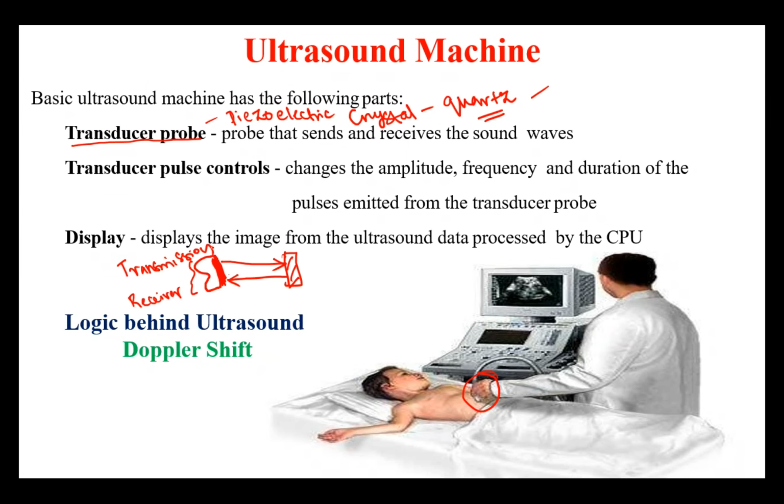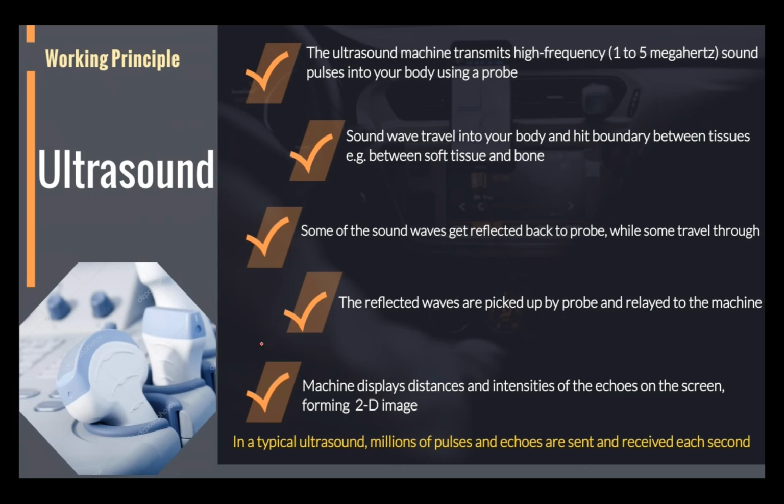So based on this concept, there are a lot of numerical questions we're going to solve. So how we get ultrasound is, I'm going to transmit a signal, I'm going to receive a signal. I receive sound waves, it's nothing but a sound wave. I'm going to transmit sound waves and receive sound waves. It hits an organ and will reflect back. That sound wave I'm going to record and convert into an image. So these are the working principles of ultrasound.